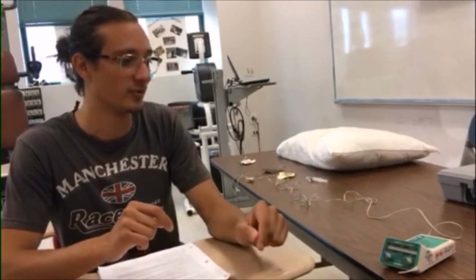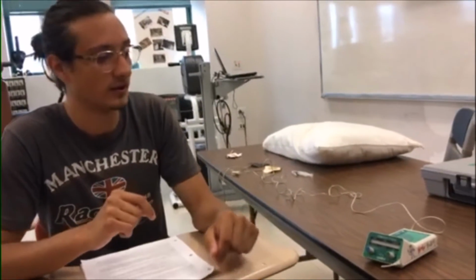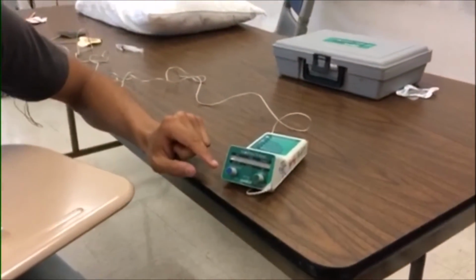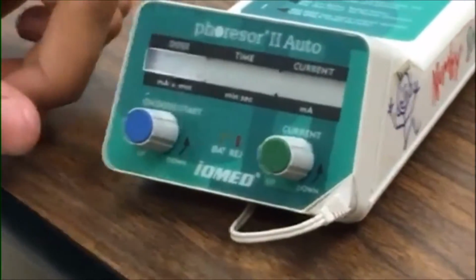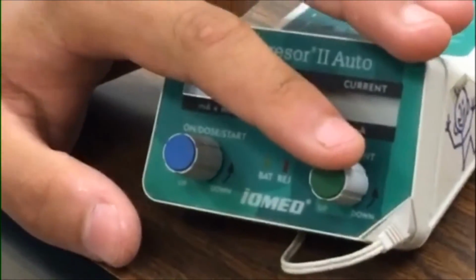Hello, my name is Stavros, and I'll be showing you more in depth how to use the iontophoresis machine. Okay, so right here we have two knobs. One knob shows the on, the dose, and the start. The other one is for the current. Now let's look more into depth with this knob. This knob will dictate the treatment time.